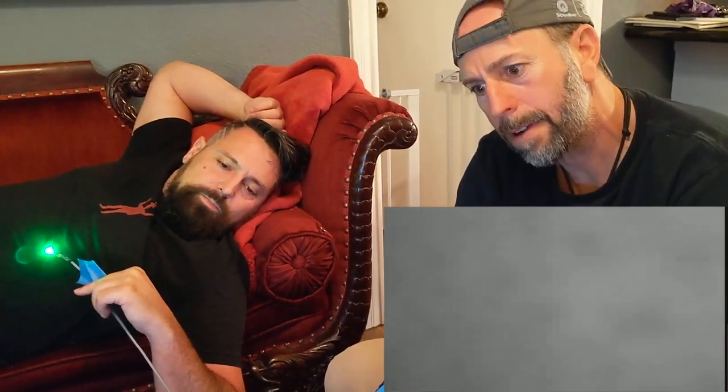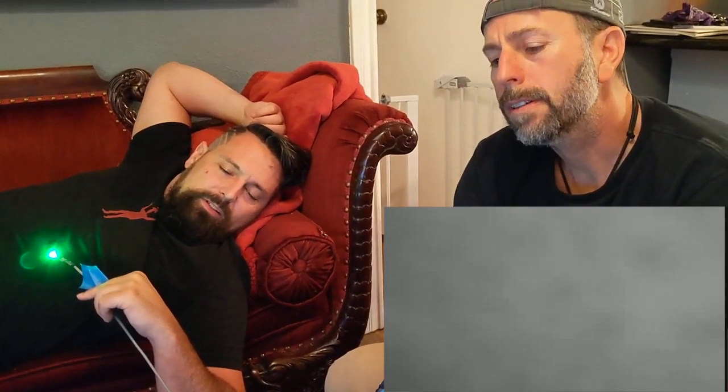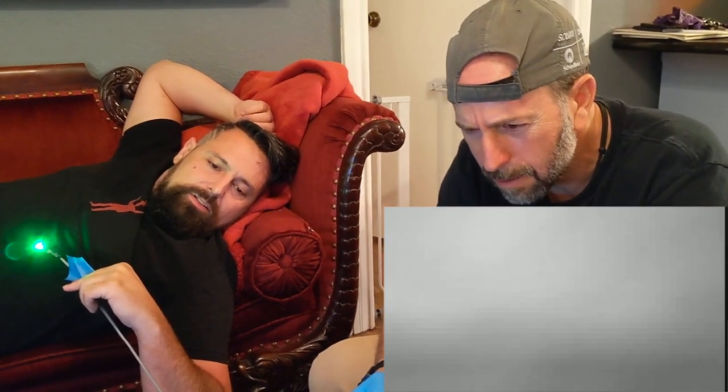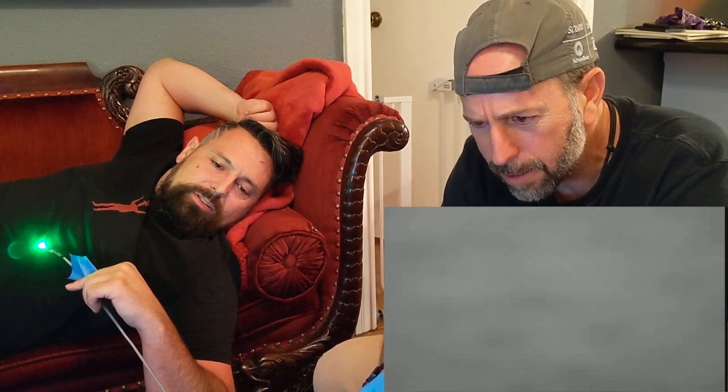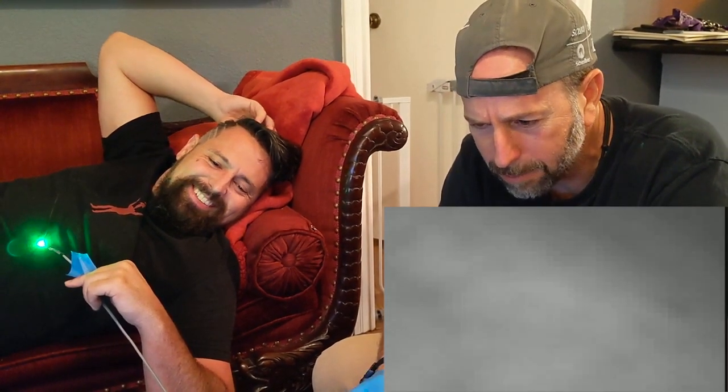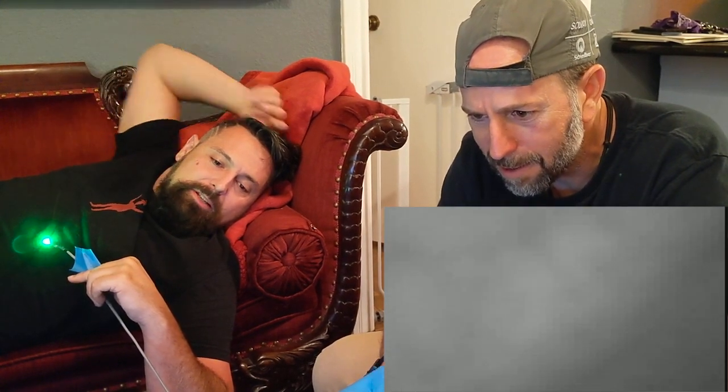Here we go. Interesting. Oh I see all kinds of things. We are scanning Tori's stomach. I'm going to go this way. Can you feel it? No, I can't feel anything. Which is weird because you know you can hear it buzzing like if it's in your mouth or something. So far I haven't heard anything.